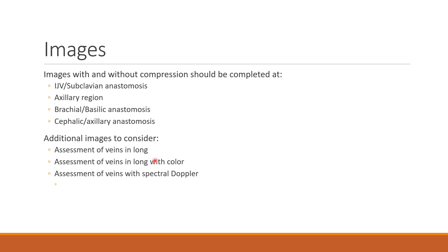For additional image views when B-mode transverse findings are uncertain, assess veins in longitudinal view, add color in long to look for any deviation patterns indicating thrombus disturbing blood flow, and use spectral Doppler to look for the expected phasicity from an open vein. Augmentation and a sniff test can also be added to enhance diagnostic capability.